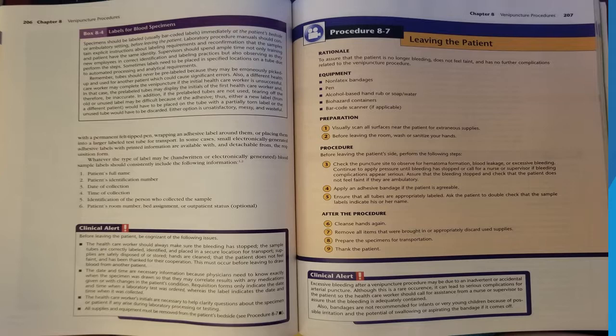Also, a different healthcare worker may complete the venipuncture if the initial healthcare worker is unsuccessful. In that case, the pre-labeled tubes may display the initials of the first healthcare worker, and therefore be inaccurate. In addition, if the pre-labeled tubes are not used, tearing off the old or unused label may be difficult because of the adhesive. Thus, either a new label from a different patient would have to be placed on the tube with a partially torn label, or the unused tube would have to be discarded. Either option is unsatisfactory, messy, and wasteful.